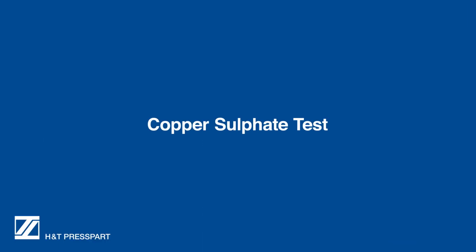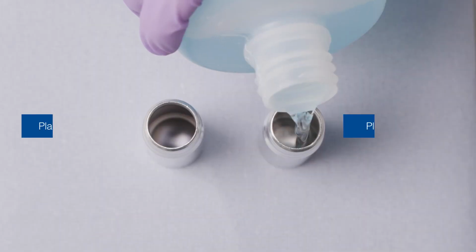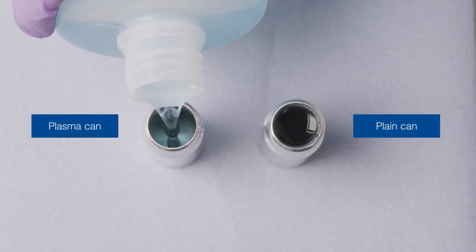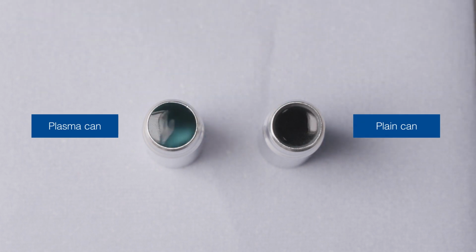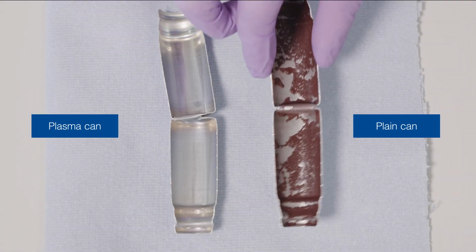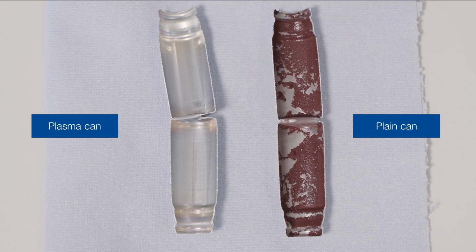The second test is copper sulfate. This checks for a uniform and robust surface. The solution is poured into the cans and left for 1 minute. After this time, the plasma can has no reaction to the copper sulfate and the plain can reacts.